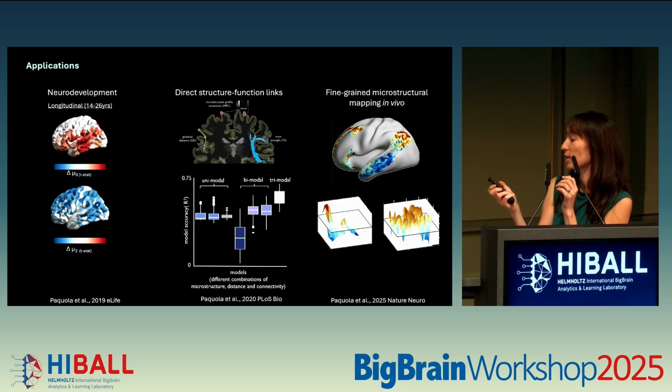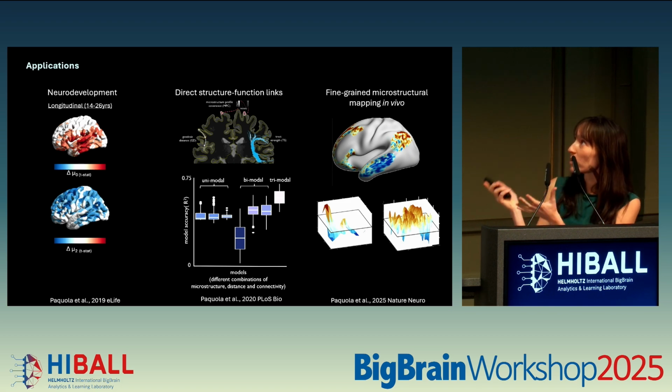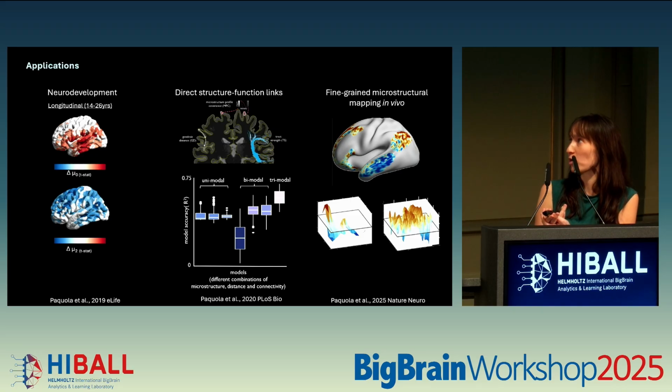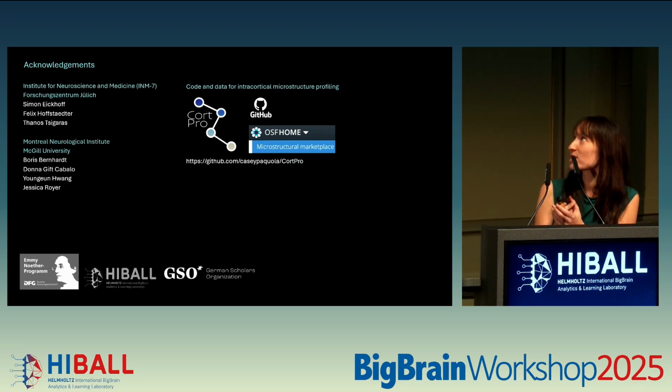So for example, in the parahippocampal gyrus, you tend to see more of a gradient, but in the prefrontal cortex, you can see this pattern of interdigitation. So this has all become possible through this translation of 3D profiling to in vivo MRI, which I hope I've convinced you is a pretty reliable approach to use and could be helpful in several studies.